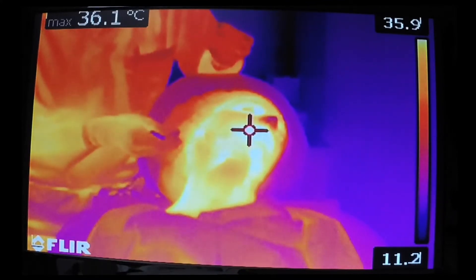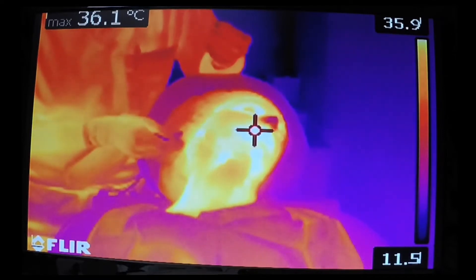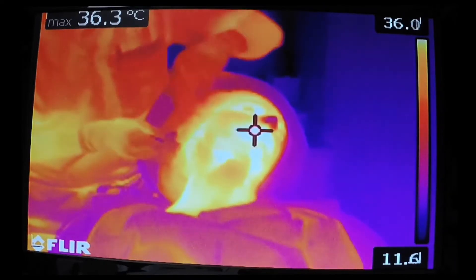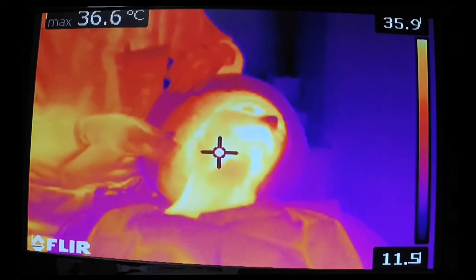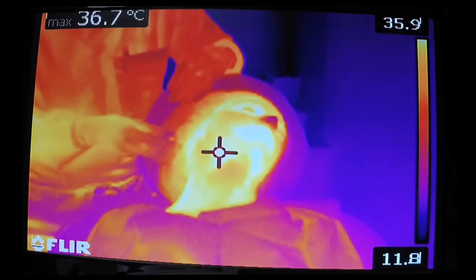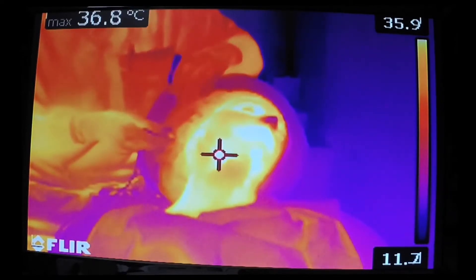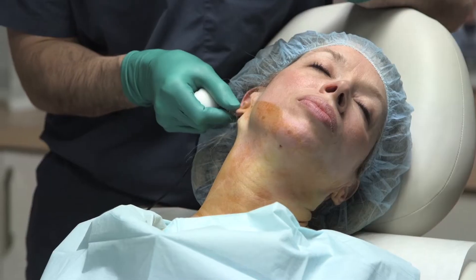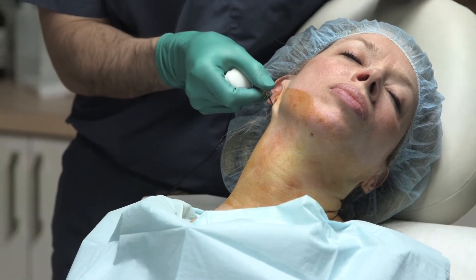During the procedure, we're actually trying to heat the fibroseptal network underneath the skin up to around 65 to 70 degrees Celsius deep. That temperature allows us to both contract the fibroseptal network through neocollagenesis and the production of new collagen, as well as melt some of the subcutaneous fat.